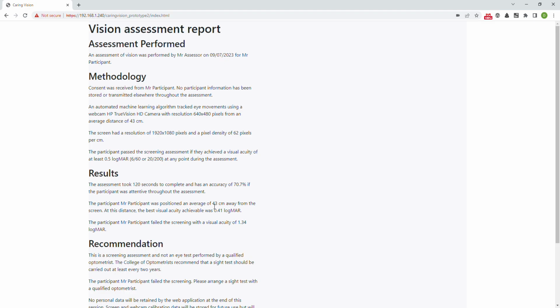The webcam has now turned off, and it's presented me with a report screen, and the report contains various details about the kind of environment I've done the test in. As you can see, I've been working at a working distance of 43 centimeters on average. The screen properties had a pixel density of 62 pixels. Certainly in the tests I've been doing, the main limitation in terms of accuracy is the actual screen resolution.